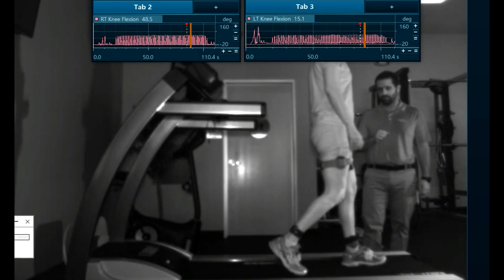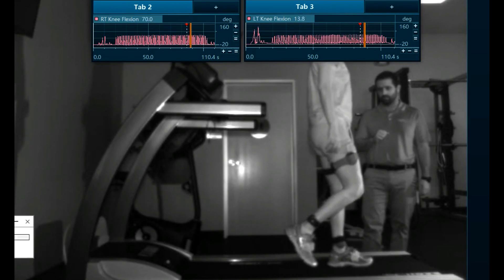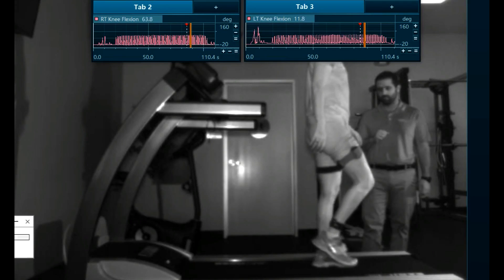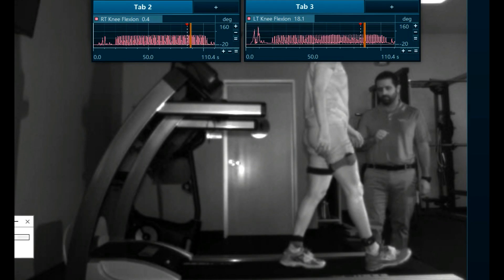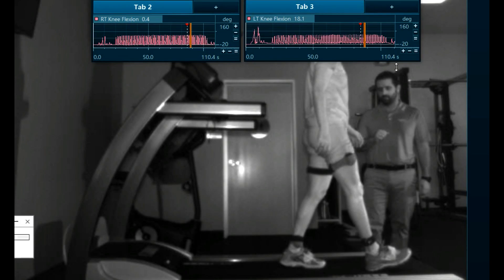I'm going to play this video through in slow motion. We're looking at the right side. I'm going to pause it right here in Initial Contact. What you see up here in these tabs are knee flexion angle measurements in real time. What we see here on the body are 3D motion sensors.